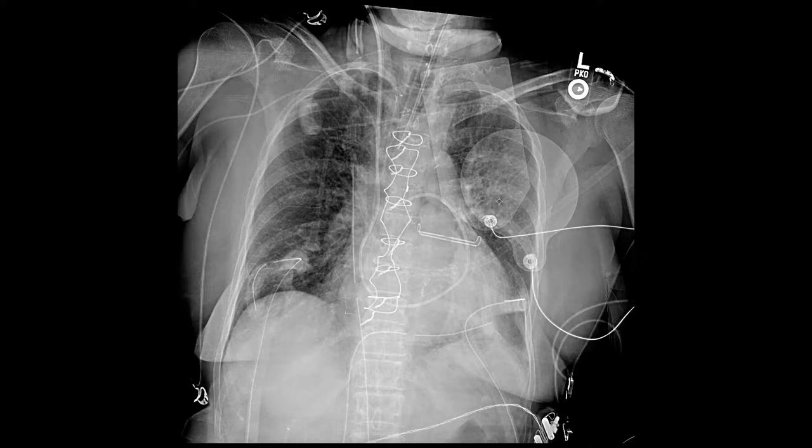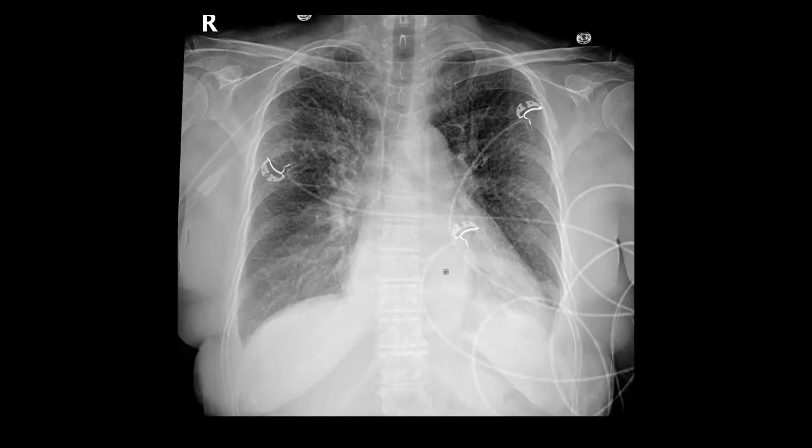Another thing I wanted to show you is the lung parenchyma itself. You see all these tiny little lines out here? You can probably see them on this side too, although not as well. This is what we call interlobular septal thickening — this is a sign of heart failure. Let me show you what this patient looked like when he came into the hospital earlier in the week. Here he has the PICC line in place, and the heart looks kind of enlarged.